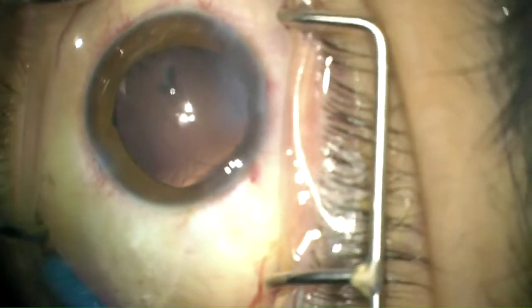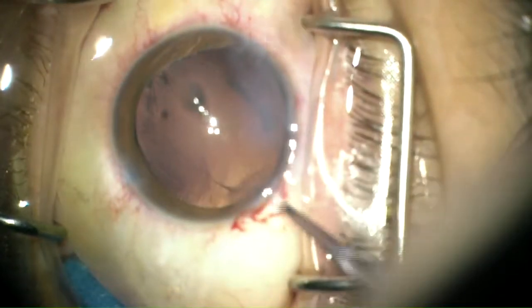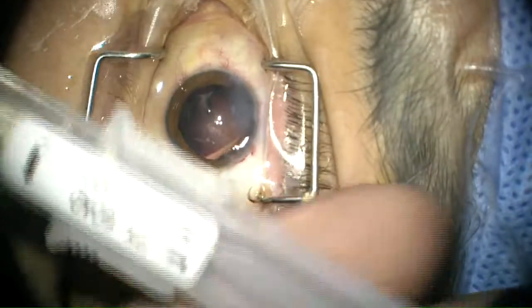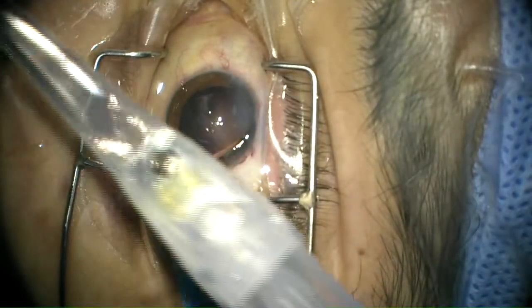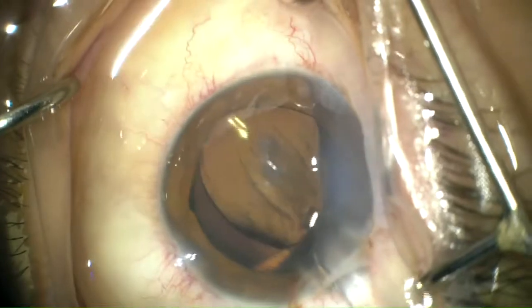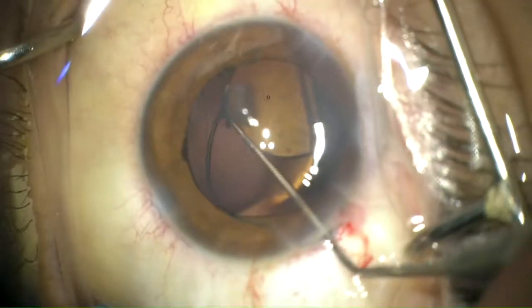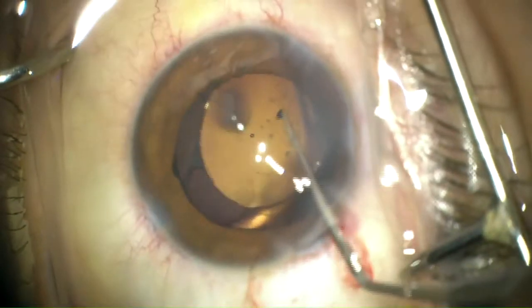The same maneuver was then repeated on the other side of the capsular rupture. Since the posterior capsule was still intact with healthy zonules, a preloaded 3-piece intraocular lens was implanted in the bag with the haptics positioned 90 degrees away from the capsular rupture to minimize any extension posteriorly.